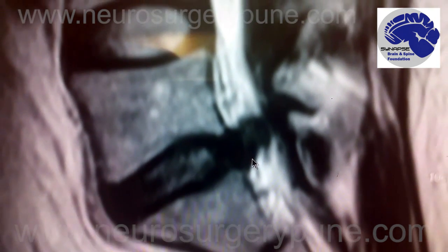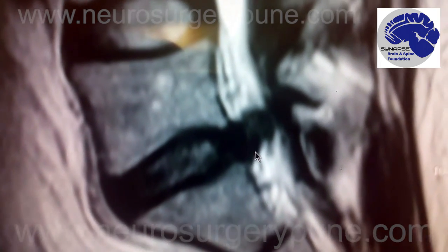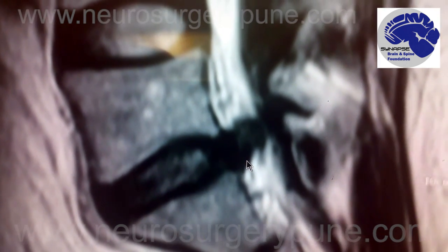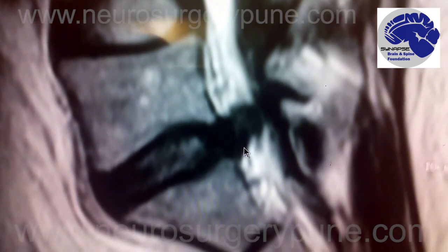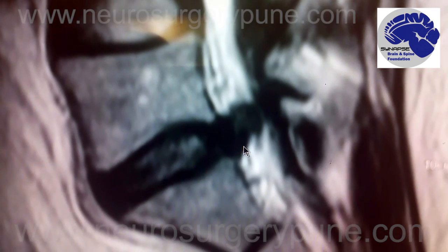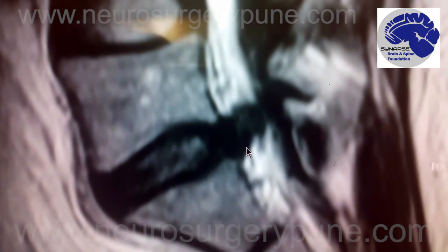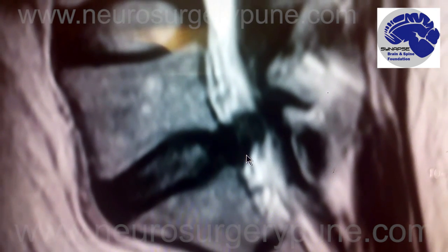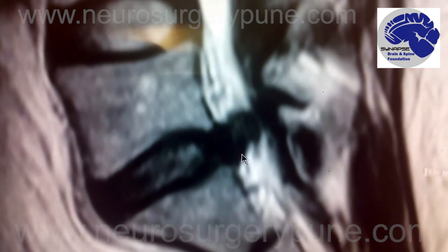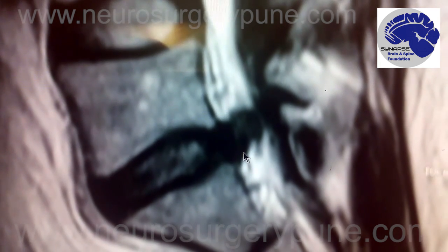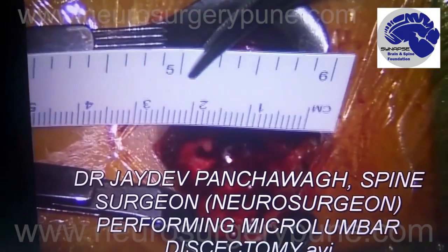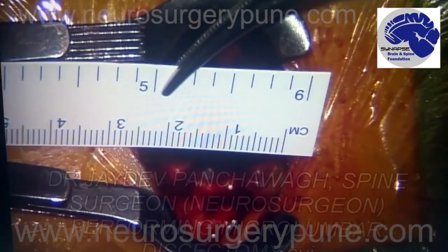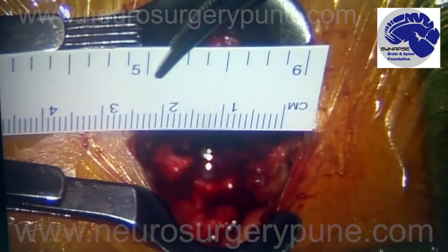We will be removing this disc thereby decompressing the nerve and relieving this person of the severe pain with a technique called MLD, which stands for micro lumbar discectomy. It is a minimally invasive procedure in which a very small incision is used to access this area. What you see here is a very small incision through which we are going to approach this.